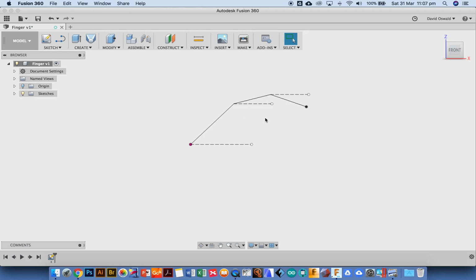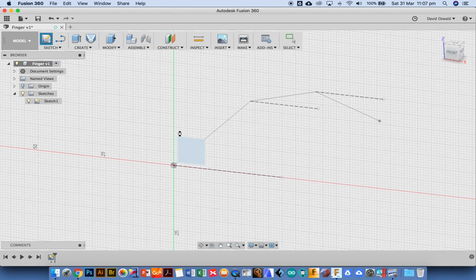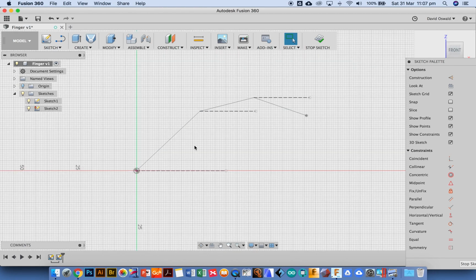It's a bit confusing what it looks like at the moment, so if I go back to here, if you imagine I had a circle, 15, 12 circle, a 10 circle and an 8. That's the very next thing we're going to do. But what I've got, I can control the angle of the finger just by controlling these lines. So let's go back and do a sketch on the same plane. Make sure it's on the same plane. And I know what I've got to do.